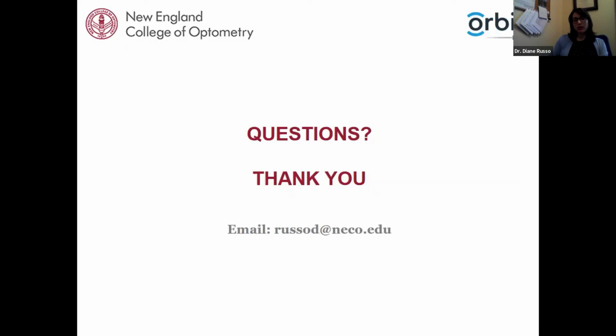And so that may be one of those instances, in the beginning where I had your four most common starting points: retinoscopy, autorefraction, lensometry, or from scratch. So one of the reasons, even if you have a retinoscope, you may not be able to get findings is if the patient has a dense media opacity or if they have exceptionally small pupils. It can be really, really difficult to get good retinoscopy findings. And so you may just have to start the refraction from a zeroed out phoropter and then make those larger changes depending on their acuity and their age and what you suspect is their refractive error.